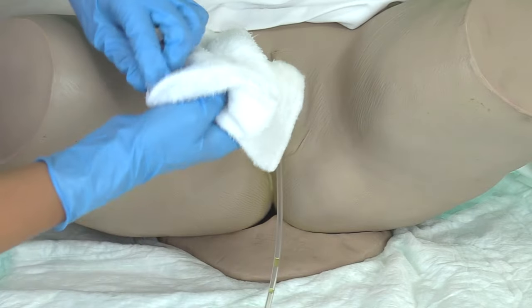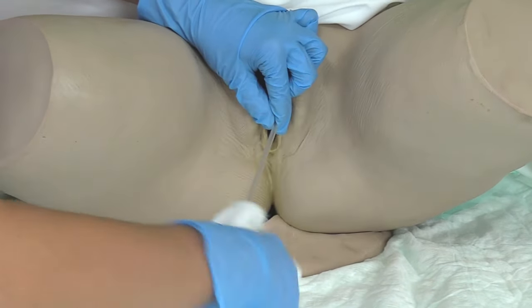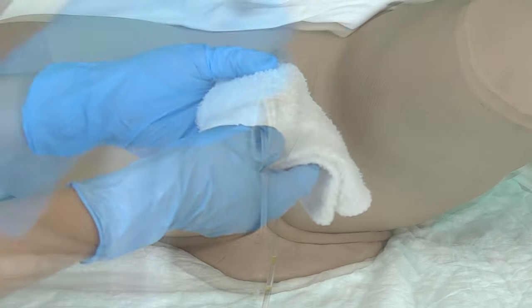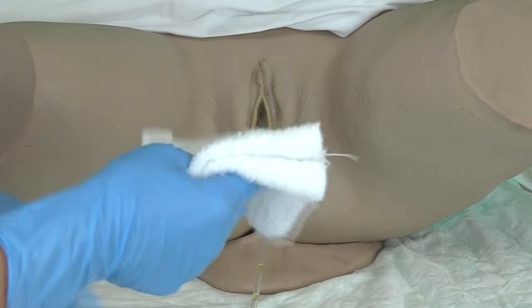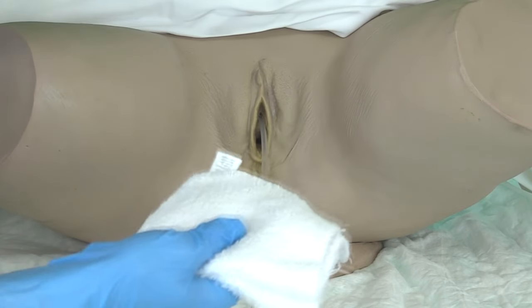And then we're going to pull back for our last leaf, hold again, and then rinse all the way down to the bifurcation. Then we're going to discard this and get a dry cloth. Now we have a dry cloth. Again, we are just going to fold that exactly like how we did before. We created our 4 leaves, and we're going to go and dry in the same way that we washed and rinsed.